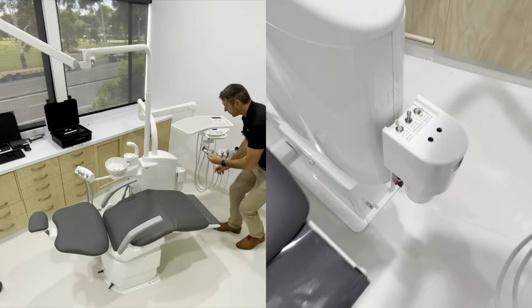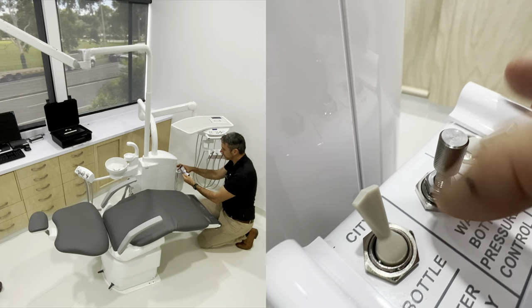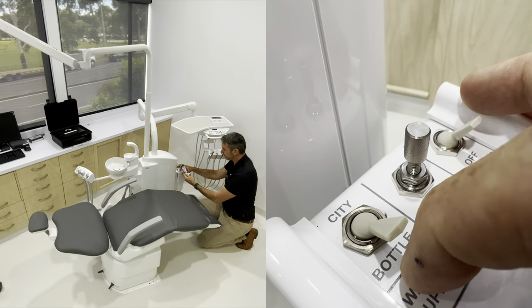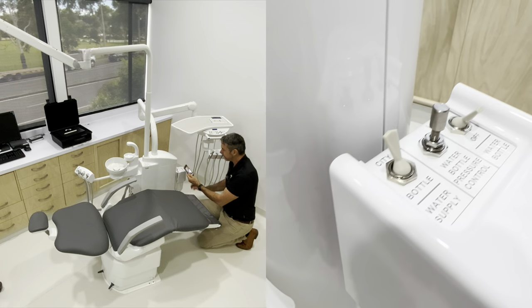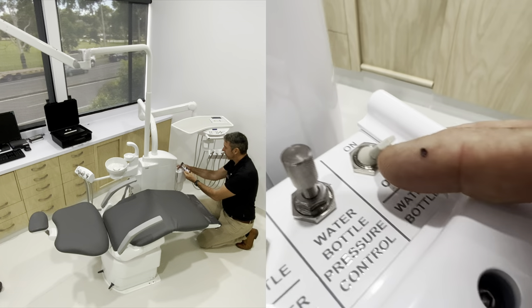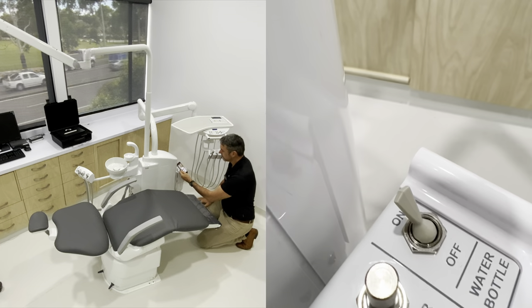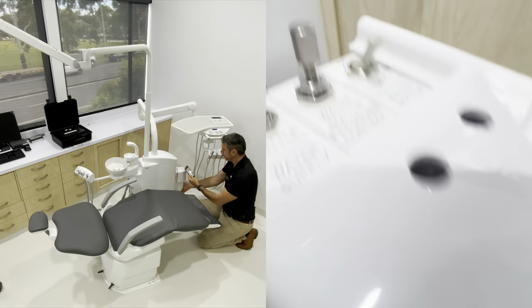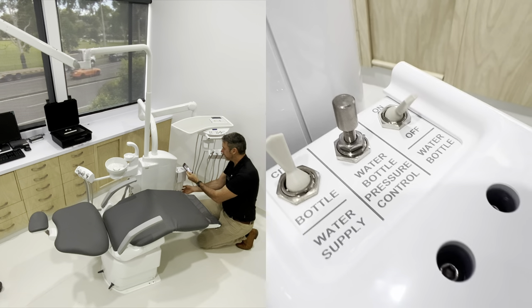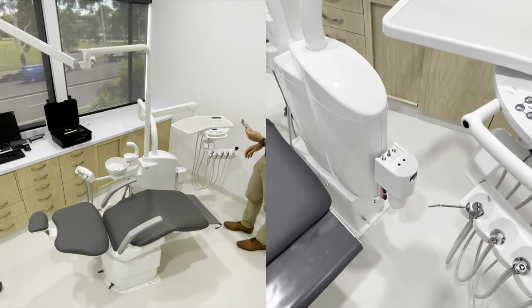While we're over here we'll do the water bottle. We've got city selection or we can choose bottle. If we're in bottle we're coming from the water bottle source; if we're in city we're using mains water. If we're using bottled water we need to pressurise the bottle to get our pressured water. If we need to remove the bottle for filling, you need to depressurise it first - check the gauge to confirm the pressure has been released.